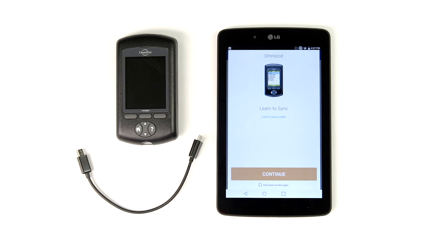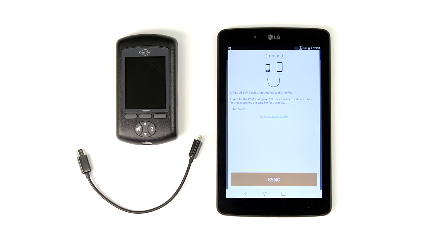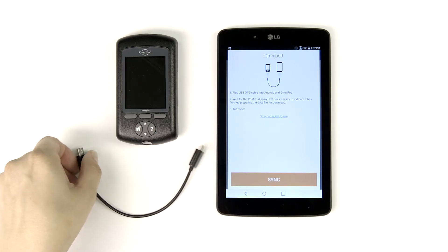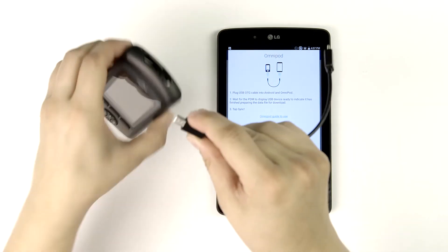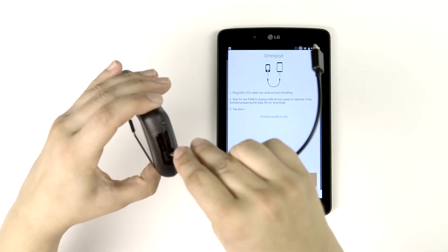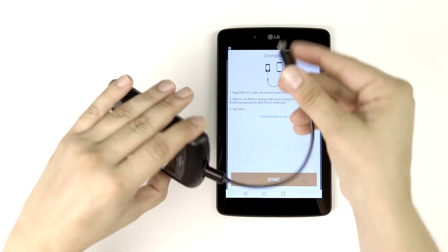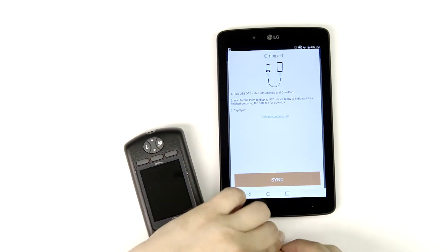Tap continue to see steps on how to set up your Omnipod for data transfer. Now insert the mini USB end of the cable into the PDM, and the micro end of the cable into your tablet.